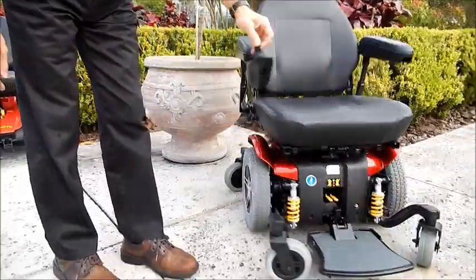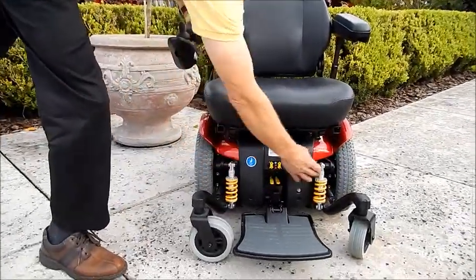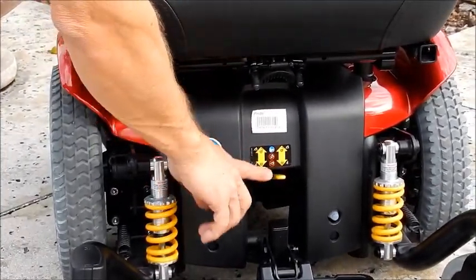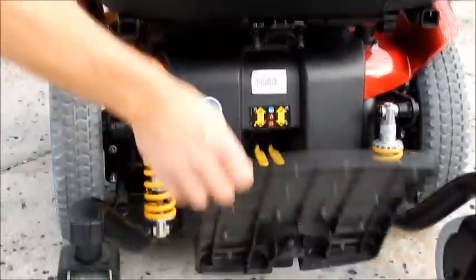This chair has a heavy-duty suspension right here, and this chair can be put in neutral right here. This puts the chair in neutral by lifting these levers. Nice footplate that flips up.